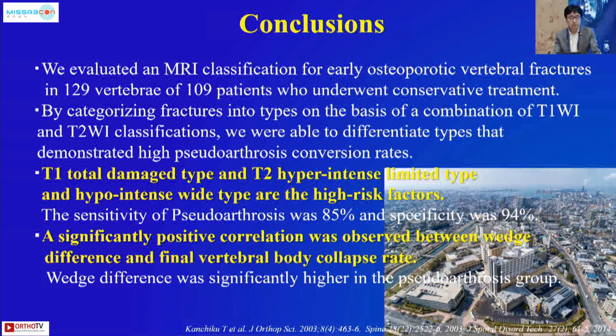A significantly positive correlation was observed between wedge difference and the final body collapse rate. Wedge difference was significantly higher in the pseudoarthrosis group.